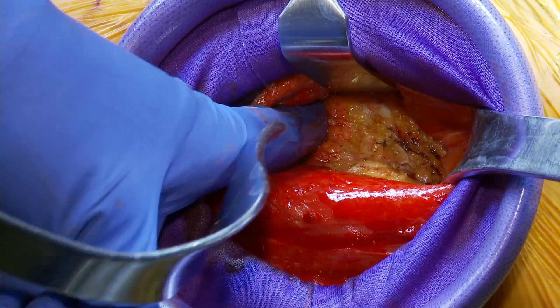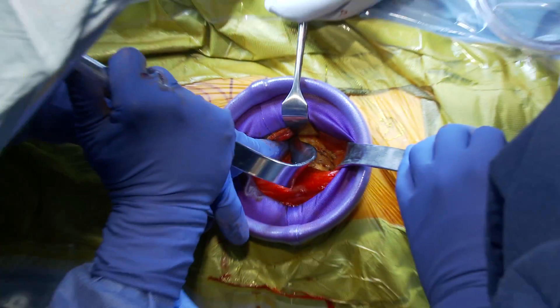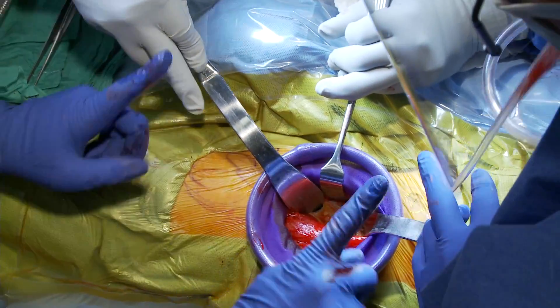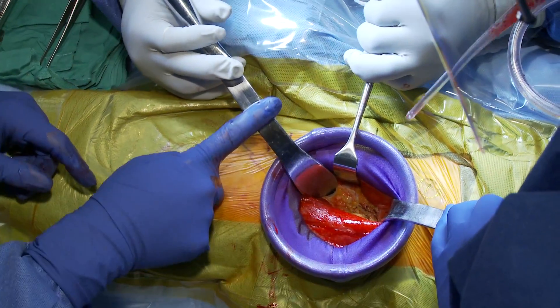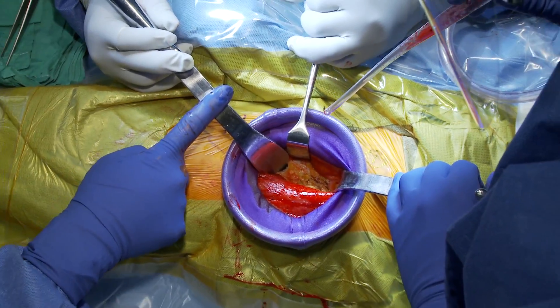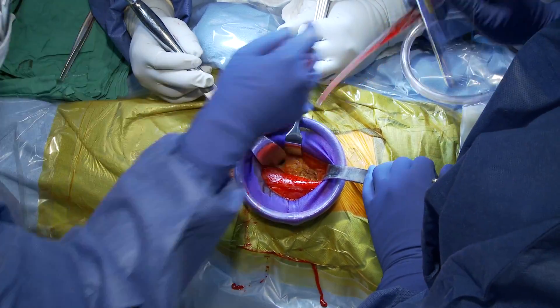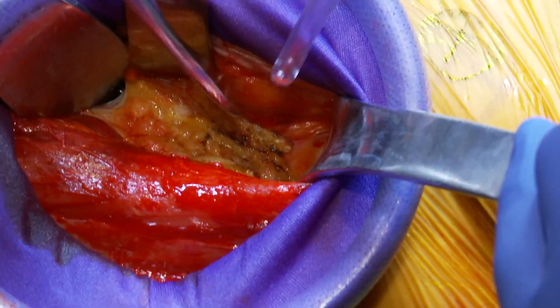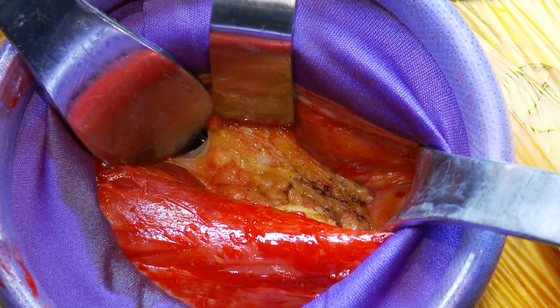I'm dissecting bluntly so I can now get under the femoral neck. We have one retractor superior to the femoral neck and one retractor inferior to the femoral neck, and now we're going to try to isolate the capsule. I'll take a deeper bovie.